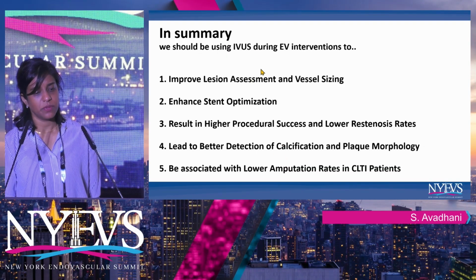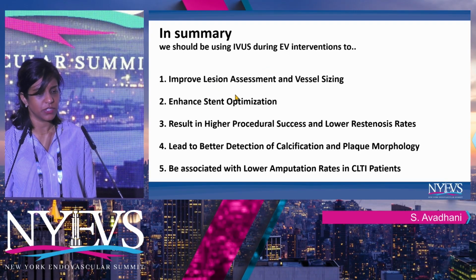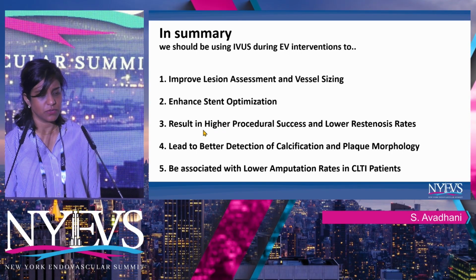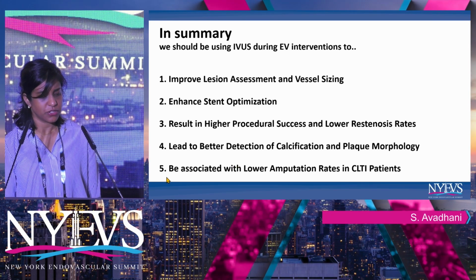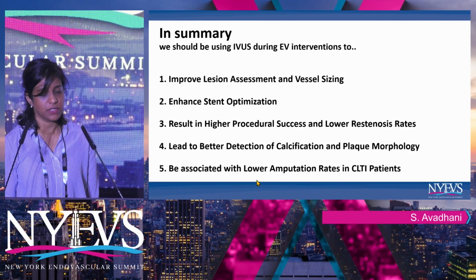In summary, we should be using IVUS during endovascular interventions to improve lesion assessment and vessel sizing, to enhance our stent optimization to result in higher procedural success and lower restenosis, also to better detect calcium and plaque morphology, and for the clinical outcomes of lower amputation rates in CLTI.